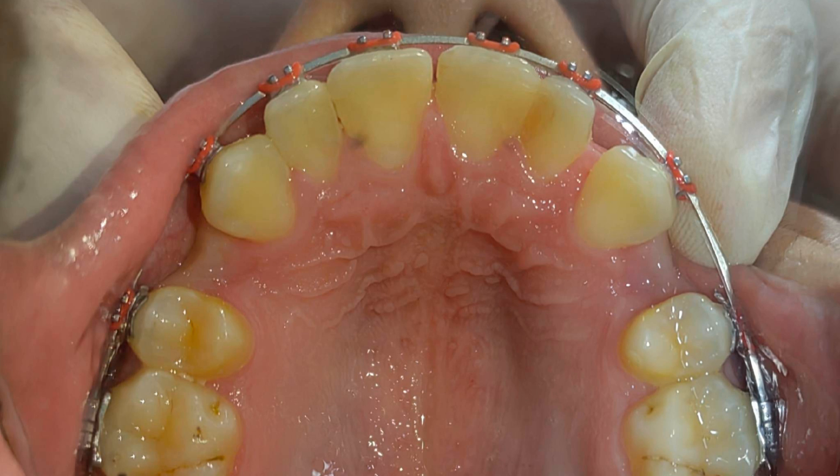This is an extraction case to correct an increase in anterior overjet. Upper first premolars are extracted bilaterally and the retraction of the canine is started.